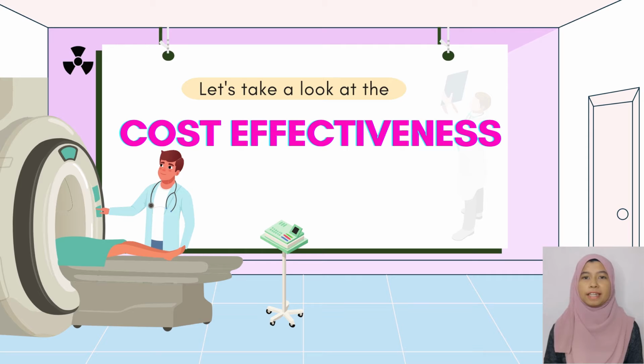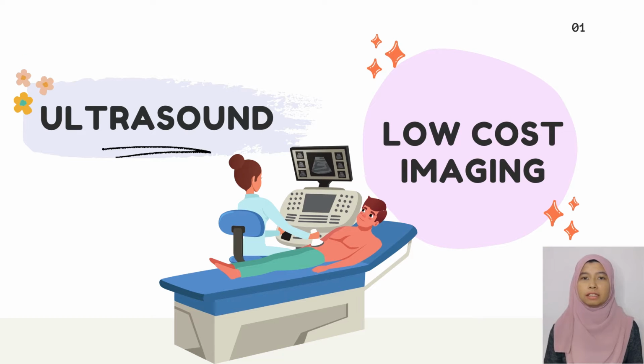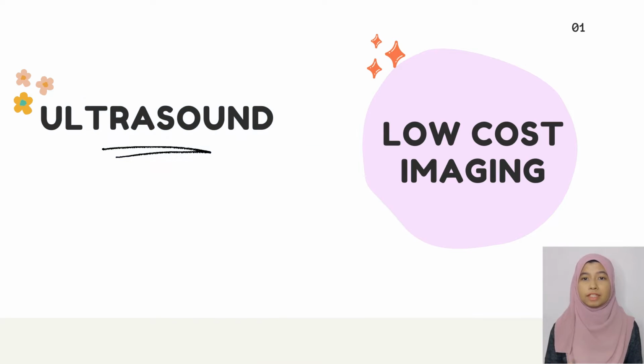Next, let's take a look at the cost effectiveness. First, one is ultrasound. Ultrasound is a low-cost imaging and the screening price is reasonably lower than any other modality. This is because it has a wide availability and non-invasive nature. It can be accessible almost from all medical facilities.